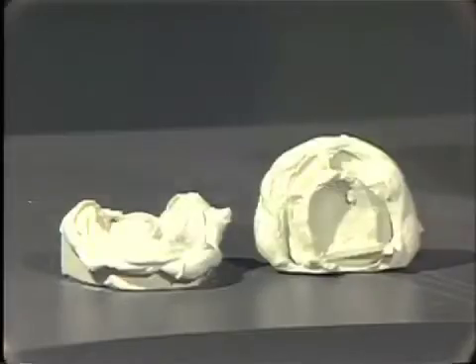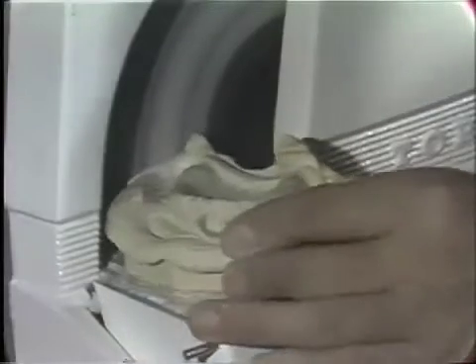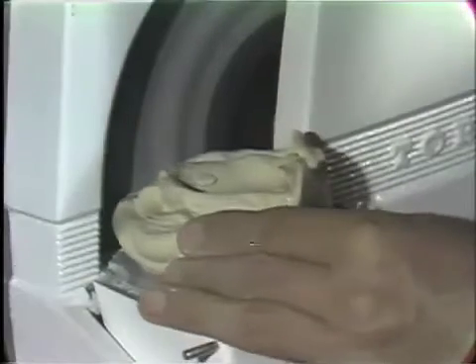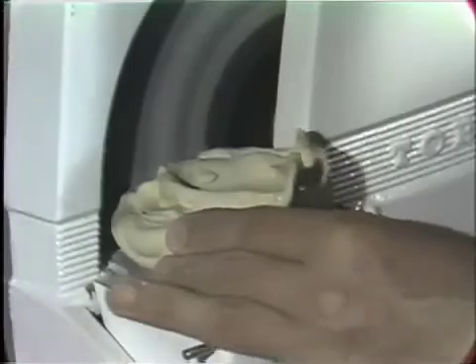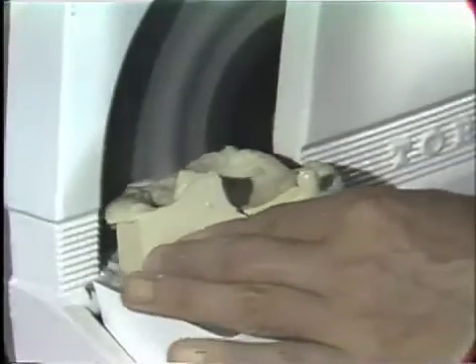After the plaster and stone impression mix has hardened, one can now separate the impression from the model and trim the model on the model trimmer. The important thing to remember in trimming the model is to maintain approximately a quarter of an inch to the landing area. This is an impression plaster and stone mix, and therefore this model cuts very easily on the model trimmer.